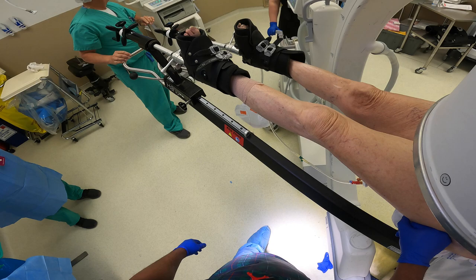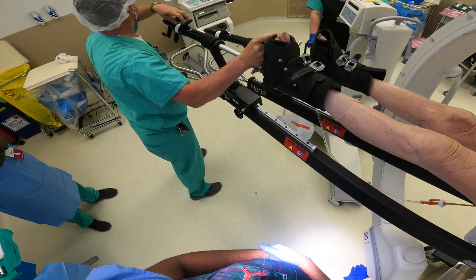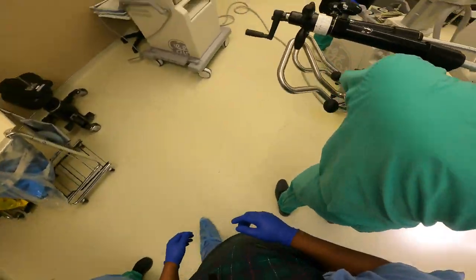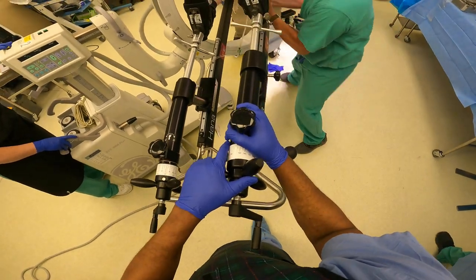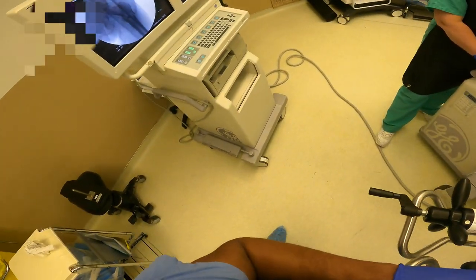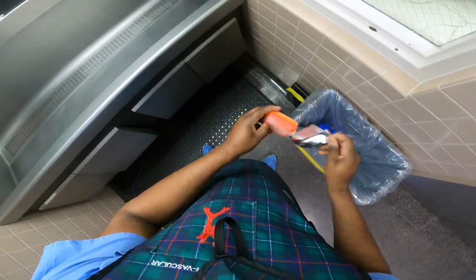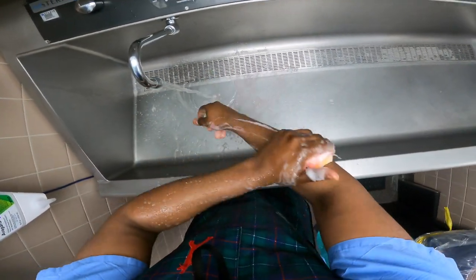I usually start off the procedure by getting some x-rays of the patient's hip fracture, and then we make adjustments to realign the bones. This is a HANA table that we use to provide some traction as well as rotation of the hip fracture so that we can realign the bone prior to even starting the surgery. Their feet are placed in these ski boots and then we can pull and adjust the legs, all while the patient's on the table. Most of these are osteoporotic hip fractures, meaning the patient has very soft bones and they fall even just from standing and break their hip.